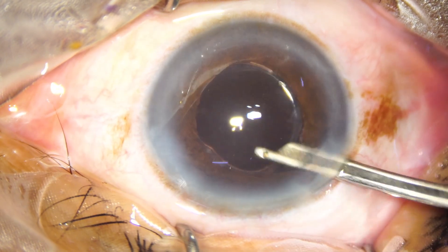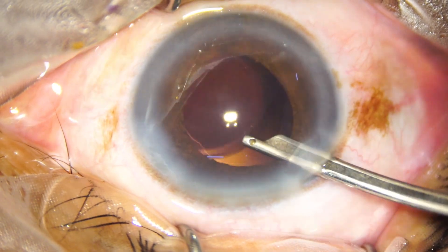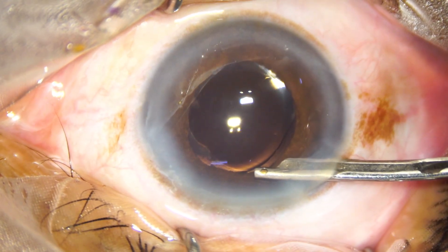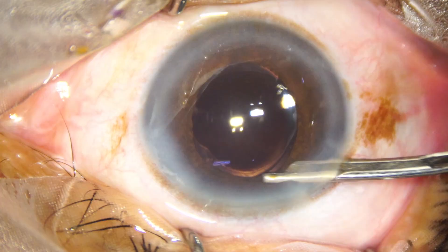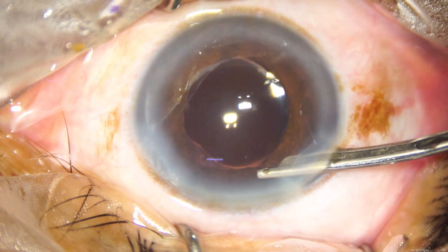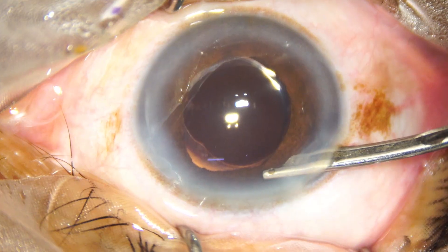I prefer to give a nice lavage at the end of the surgery. Clear fluid should be present — everything should be clean at the end of the surgery in the anterior chamber.